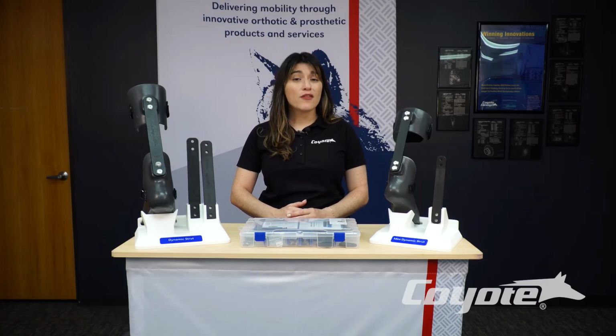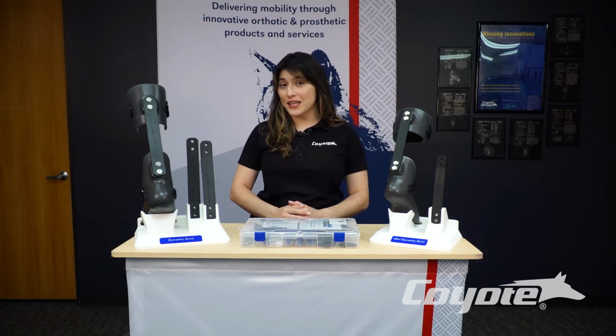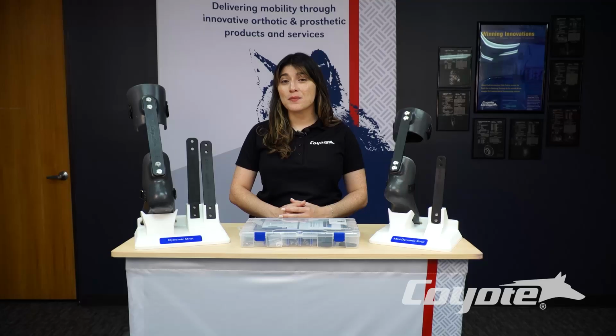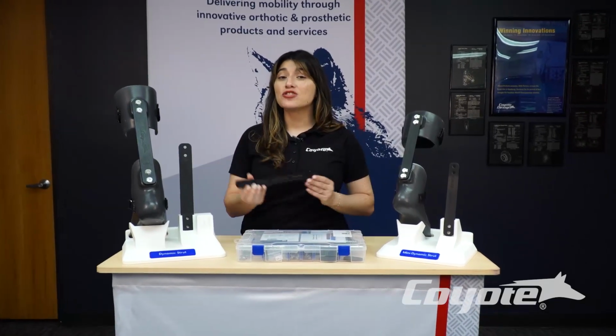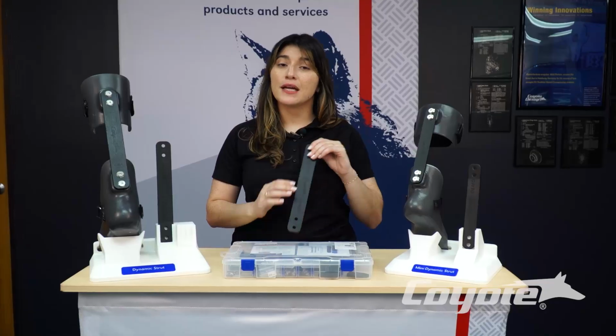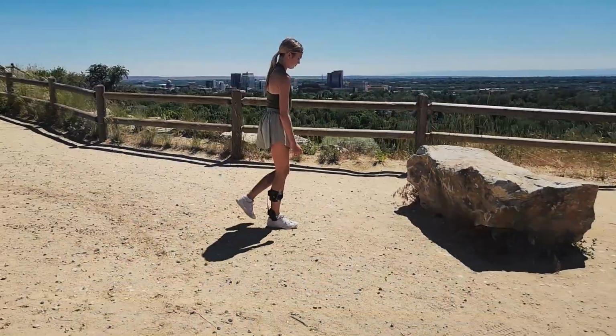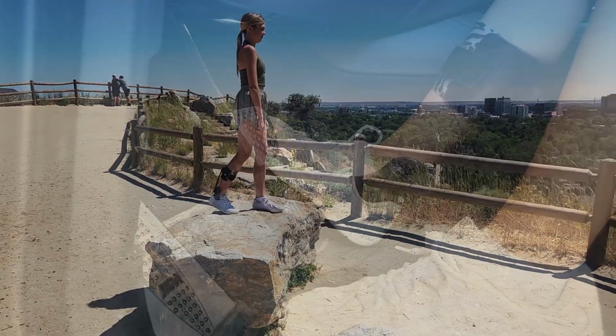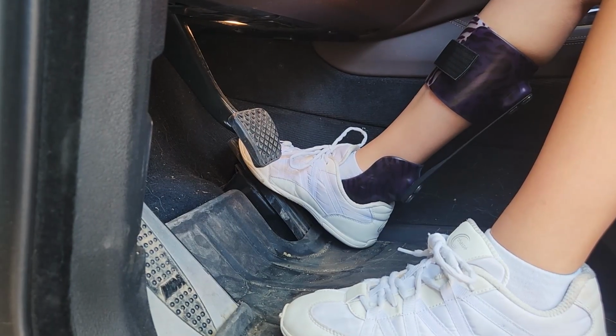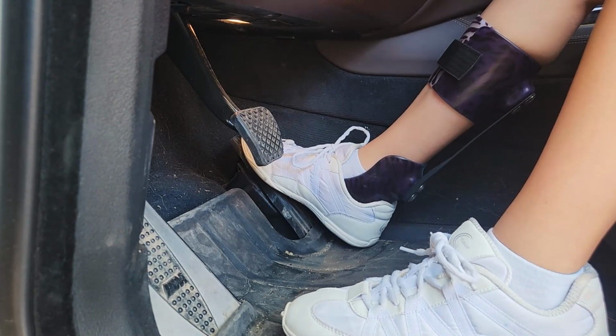In this video, we're going to talk about how to choose the right flexibility strut when utilizing Coyote's dynamic strut. We offer both a mini and a standard dynamic strut, which allows for optimizing the fit and function for your patient. Our standard dynamic strut is 10.5 inches by 1.5 inches, while our mini is a little bit smaller, perfectly suited for more pediatric and adult populations. This one is 8.5 inches by 1.25 inches, so slightly smaller.